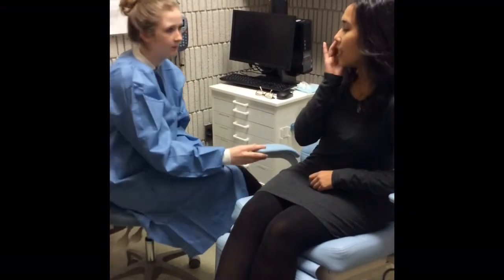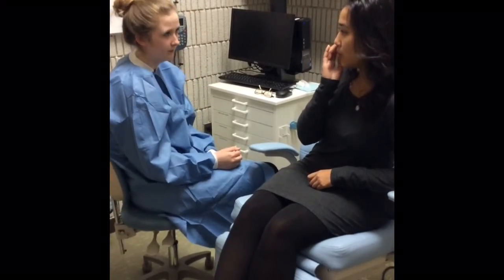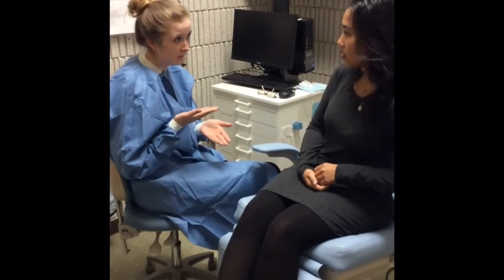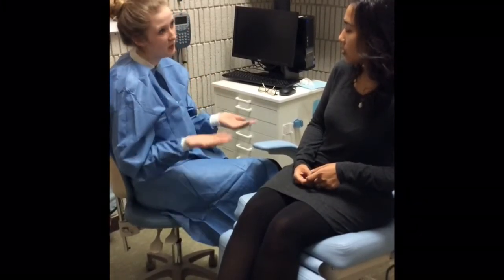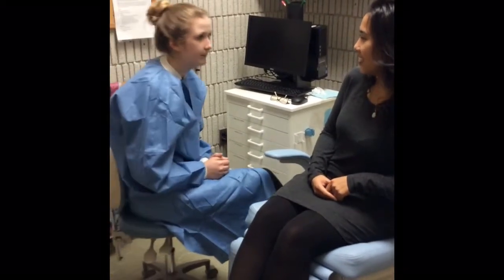Okay, that makes sense. I was feeling a lot of pain around my cheeks too. So will that show anything that's going on around there as well? Well, if the tooth is more into your upper jaw, it could have, or it just damaged the bone around it. It could have really made everything swollen, but we won't know until we do the 3D imaging to see if anything's going on or destroyed anything up there. Okay. All right. Thank you.